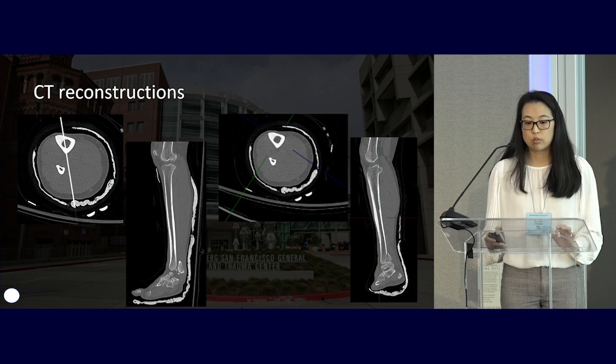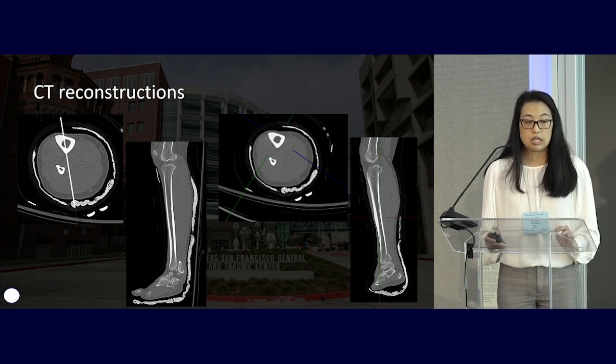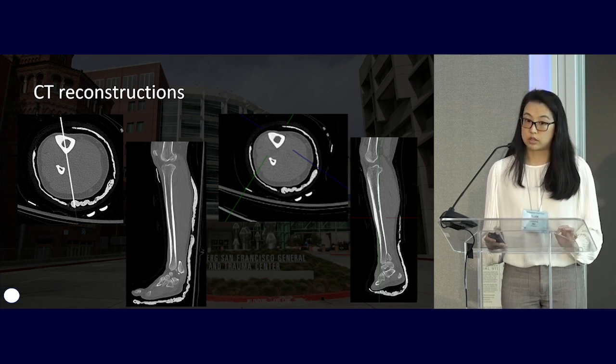On the images on the right, you can see that these are reformats that we have generated on the reading workstation in the actual sagittal plane with respect to the calf, and the sagittal images are much more on plane, and this can be helpful in confirmation of the degree and direction of displacement and dislocation, as well as for confirmation of subtle osseous findings in multiple planes.